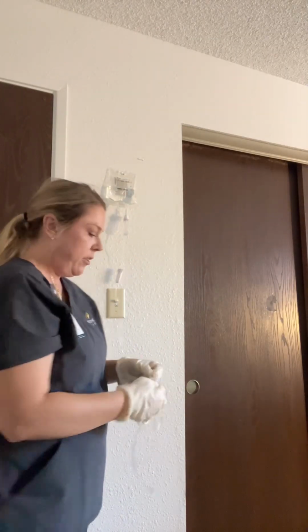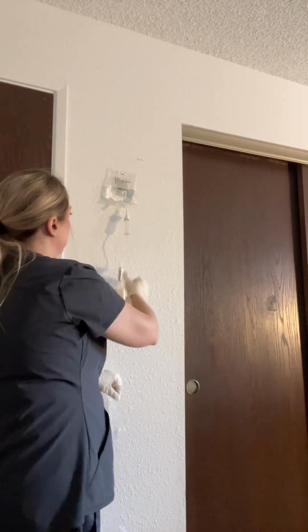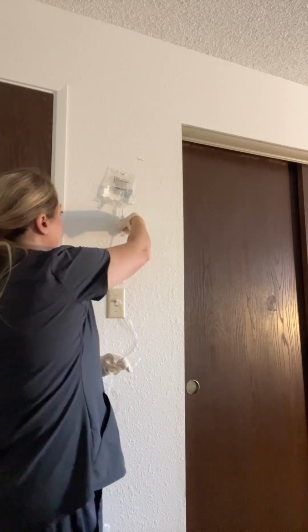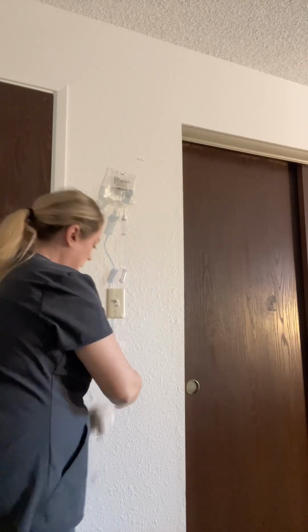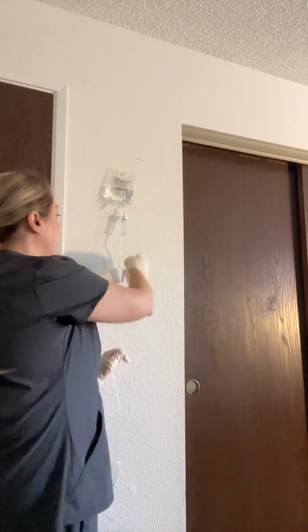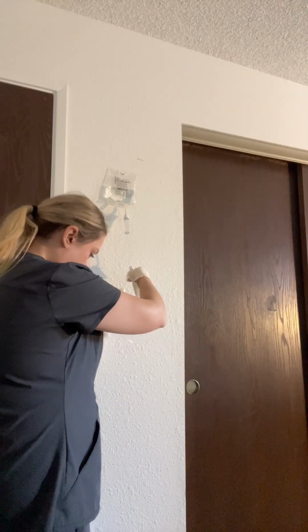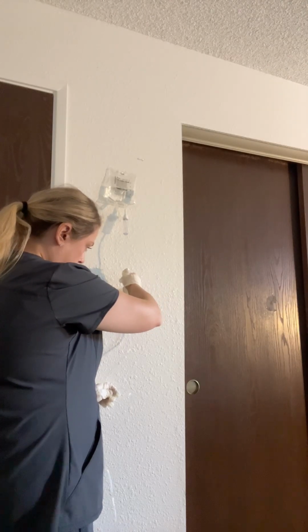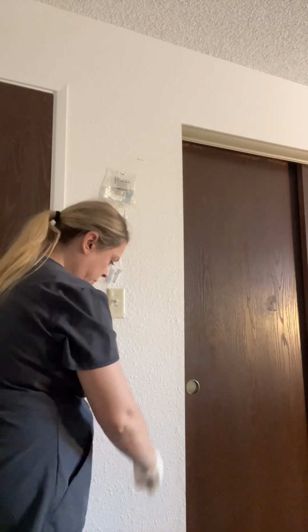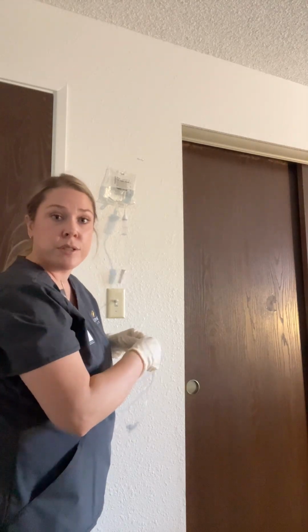Okay, we want to fill the drip chamber halfway when we're ready. Again, making sure our roller clamp is closed so that the fluid doesn't rush out, but we want to fill our drip chamber halfway. Okay, and next we want to prime the tubing to make sure all the bubbles are removed from the tubing. So we're going to go ahead and do that now. We're going to open up our roller clamp and get all those bubbles out. Also, I want to remove the adapter cap so that the bubbles can come out.